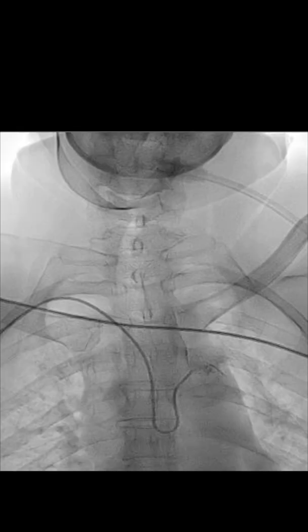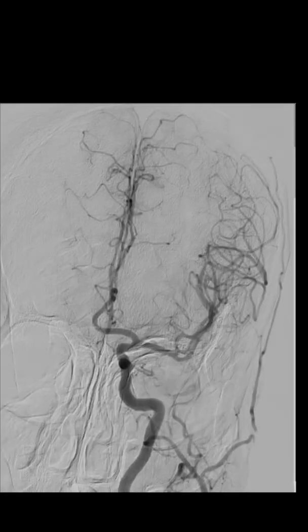Now, from the CT angio image which we already have, we can easily make out this is the subclavian artery coming through the brachiocephalic trunk into the arch of aorta, and it has taken a curve and gone into the subclavian, or probably into the left common carotid artery. We'll have to take a shot and see what is happening. So it is the left common carotid artery.